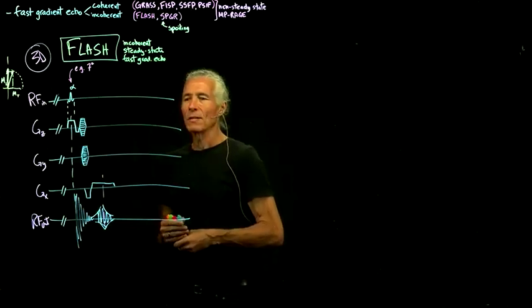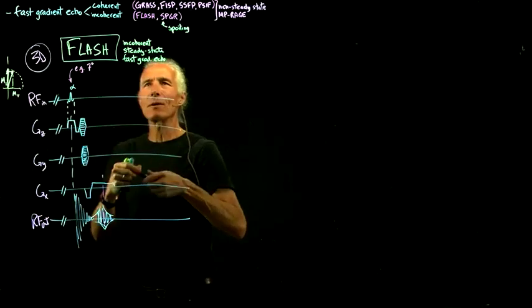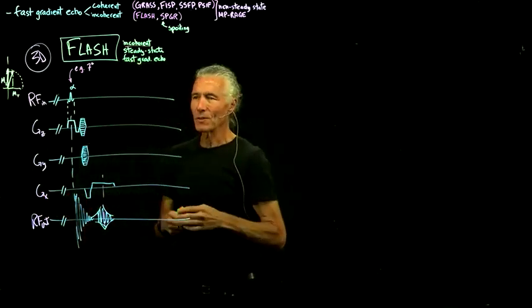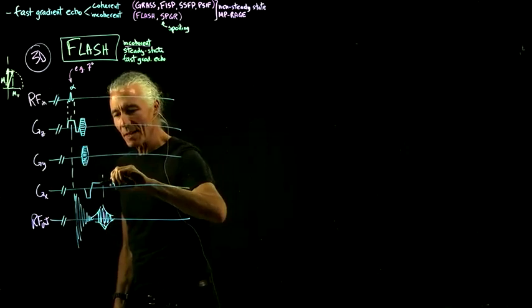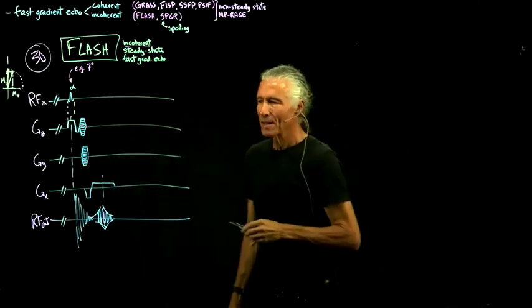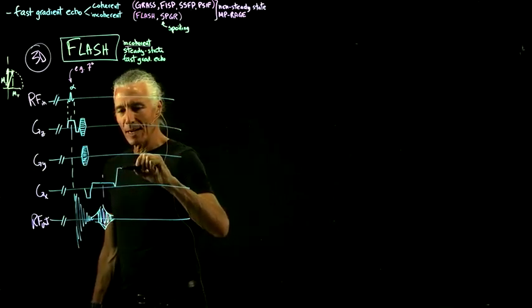And so now the incoherent part. So how do we mess it up? The two main things that we do. One way of messing up some leftover magnetization is we can dephase it. And so what we do is we just put some gradients on.